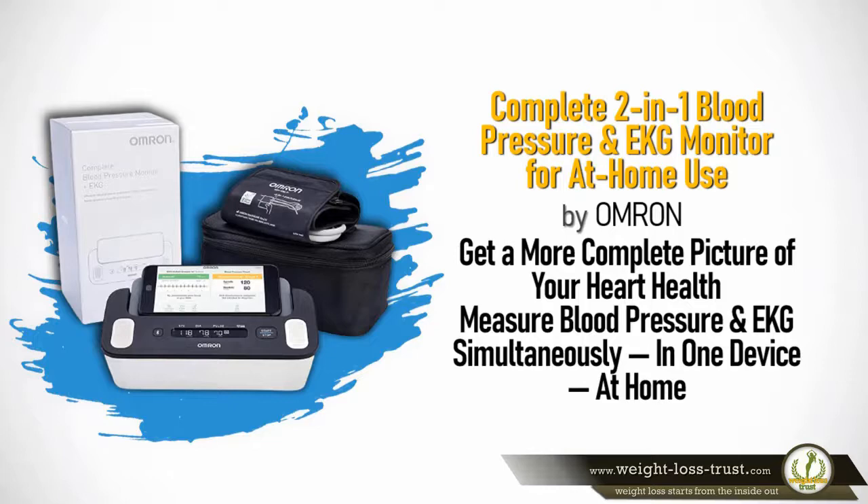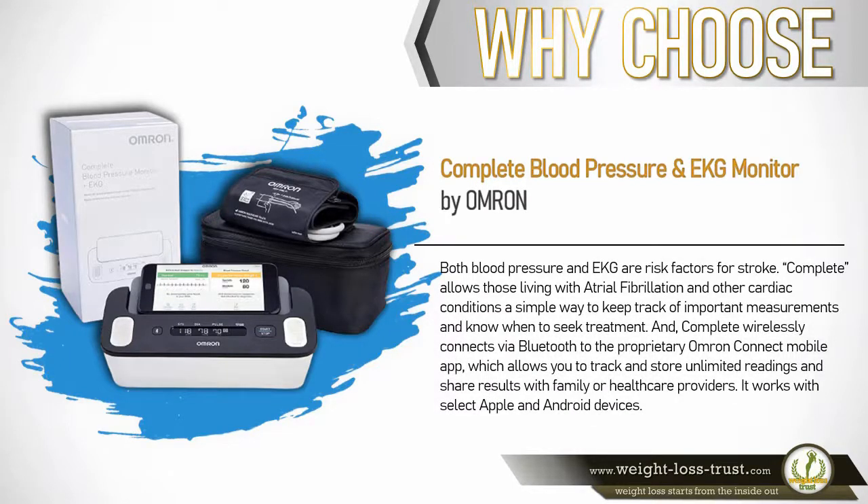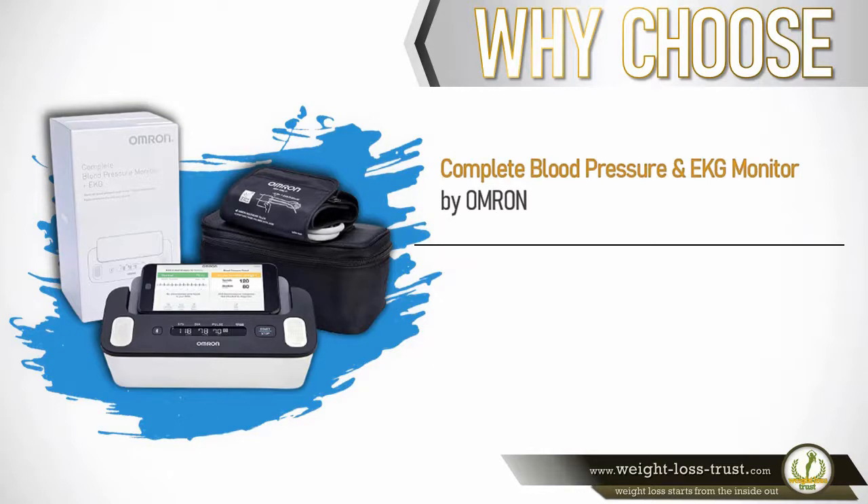Measure blood pressure and EKG simultaneously in one device at home. Why choose the complete 2-in-1 blood pressure and EKG monitor by Omron? Both blood pressure and EKG are risk factors for stroke. Complete allows those living with atrial fibrillation and other cardiac conditions a simple way to keep track of important measurements and know when to seek treatment. Complete wirelessly connects via Bluetooth to the proprietary Omron Connect mobile app, which allows you to track and store unlimited readings and share results with family or healthcare providers. It works with select Apple and Android devices.